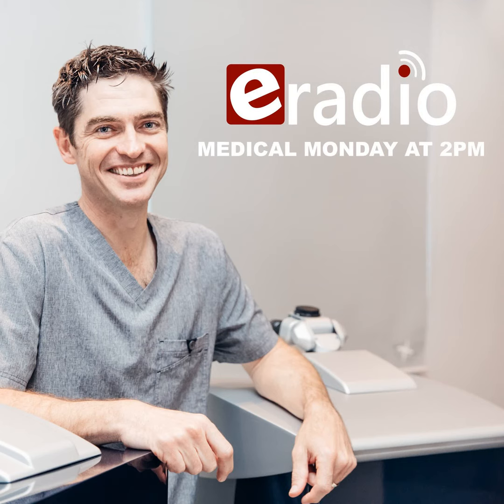And the first part of the procedure is a machine which we call a femtosecond laser. So femtosecond is a quadrillionth of a second. That's the frequency at which this laser fires the pulses. And actually, when it fires the pulses, it creates plasma. So as opposed to the previous generations of flap creators, which were actually blades, or what we call a manual keratome, the current way of doing it now is using a laser, which delivers pulses that quickly, and it literally puts about 2 million little pulses or gas bubbles into a predetermined depth in your cornea.